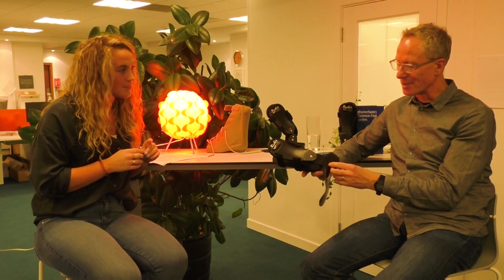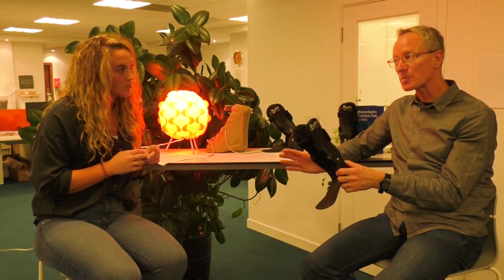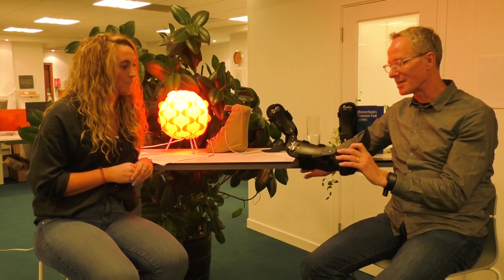Yeah, I think also in the early days when I started using these, I was using a standard Richie Brace sometimes for the more advanced pathologies, and sometimes it worked. So I was using it with the arthritic, end-stage type conditions, and for whatever reason it offloaded and it gave the person relief. There's also the occasion when you attempt to use a Richie Brace and the horse has bolted, the person actually needs surgery. So once you enter into using these types of products, you're explaining to your patient that it's a conservative approach, and it may work or it may not, and it really depends on the pathology and how advanced it is and how to manage it.